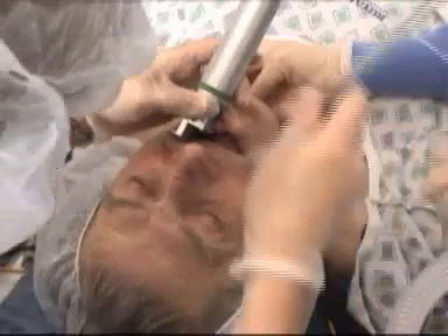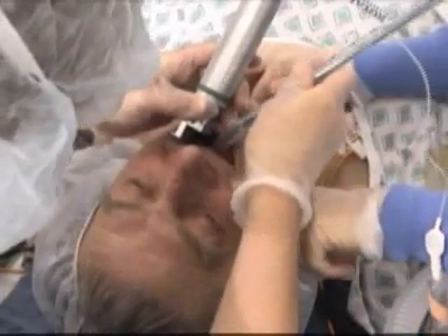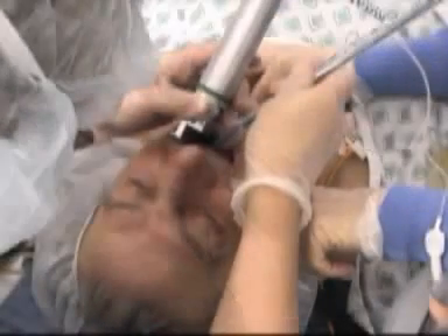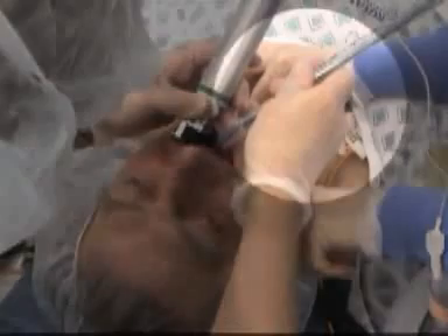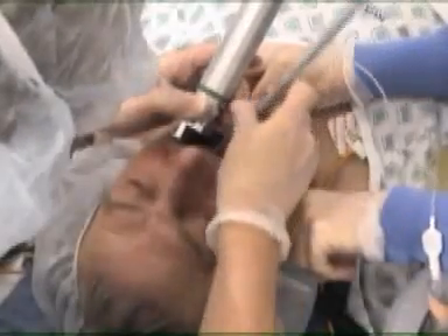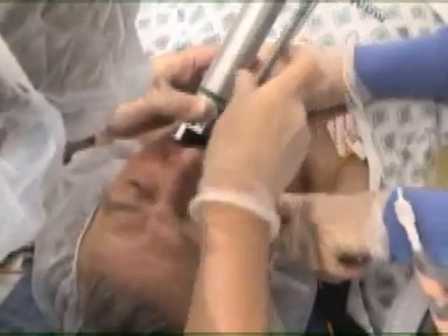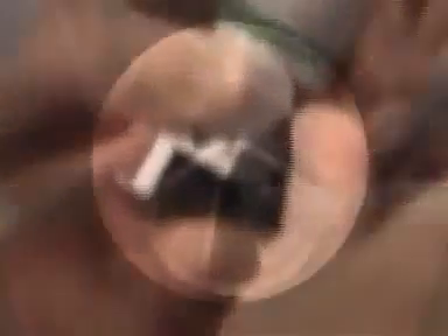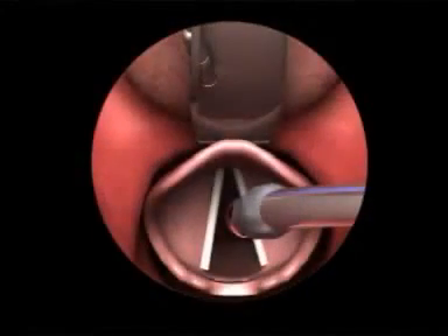If available, an assistant should gently pull on the right side of the cheek to enhance visibility of the glottis. Hold the endotracheal tube in your right hand. While maintaining your view of the vocal cords, insert the endotracheal tube into the right side of the patient's mouth. The tube should not obstruct your view of the vocal cords during this critical part of the procedure.